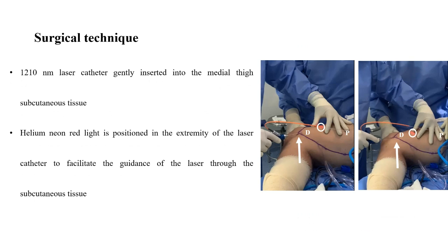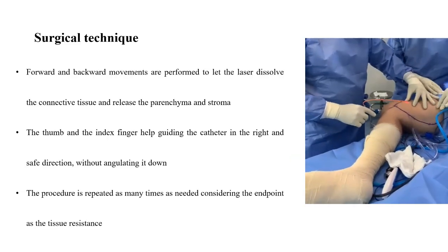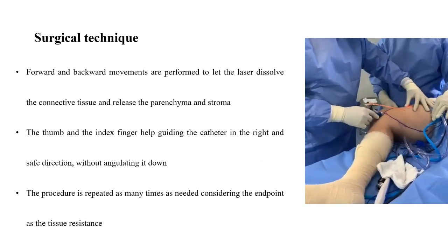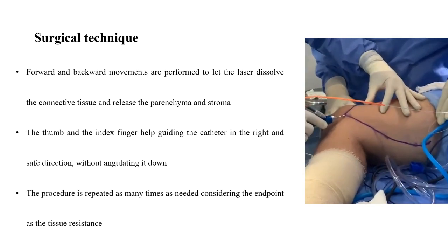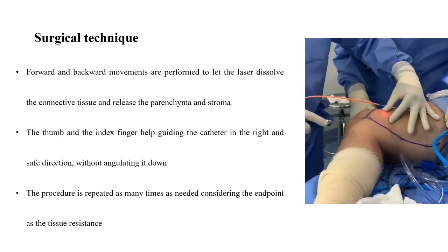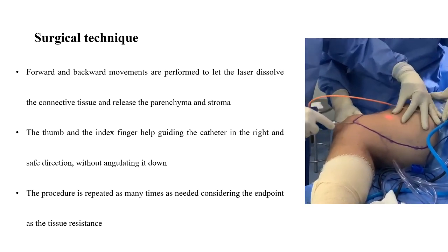A 1,210 nm laser catheter is gently inserted into the medial thigh subcutaneous tissue. A helium-neon red light is positioned at the extremity of the laser catheter to facilitate guidance through the subcutaneous tissue. Forward and backward movements are performed to let the laser dissolve the connective tissue and release the parenchyma atraumatically. The thumb and index finger help guide the catheter in the right and safe direction without angulating it down into the deeper layers of the thigh. The procedure is repeated as many times as needed, with the endpoint being tissue resistance.